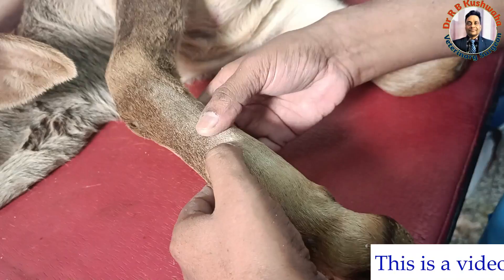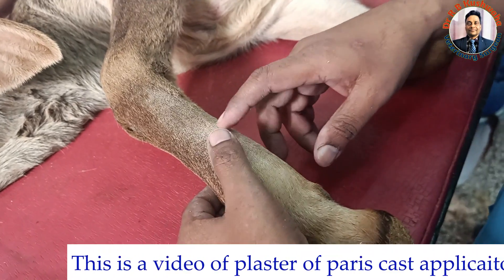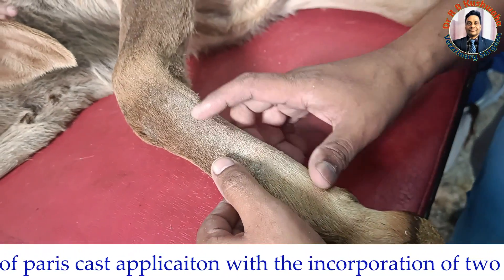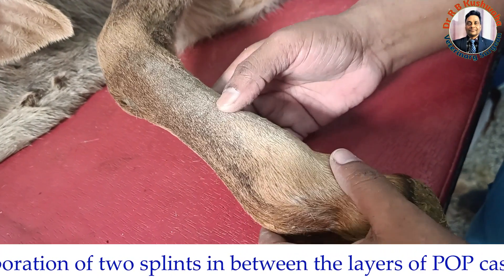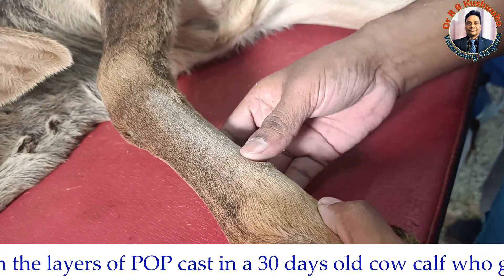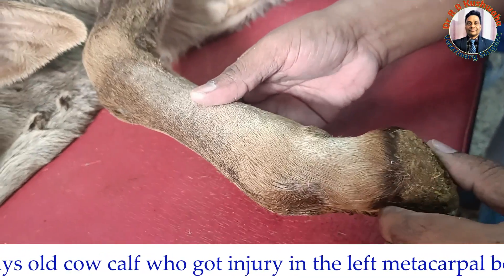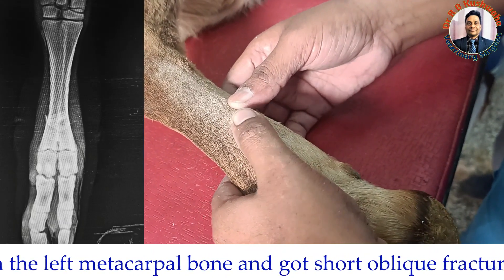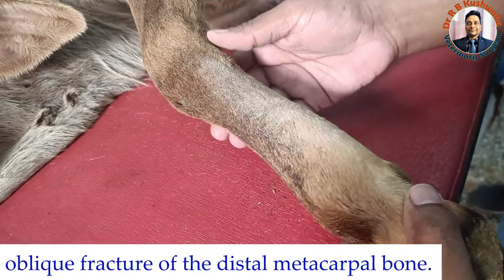This calf has an injury in the distal metacarpal area. The injury happened yesterday when another animal stepped on this metacarpal area. After physical examination and radiograph, we found a fracture in the distal metacarpal bone. Externally there is no wound over the skin and the swelling is also not significant. It is a distal one-third short oblique fracture of the left metacarpal bone.